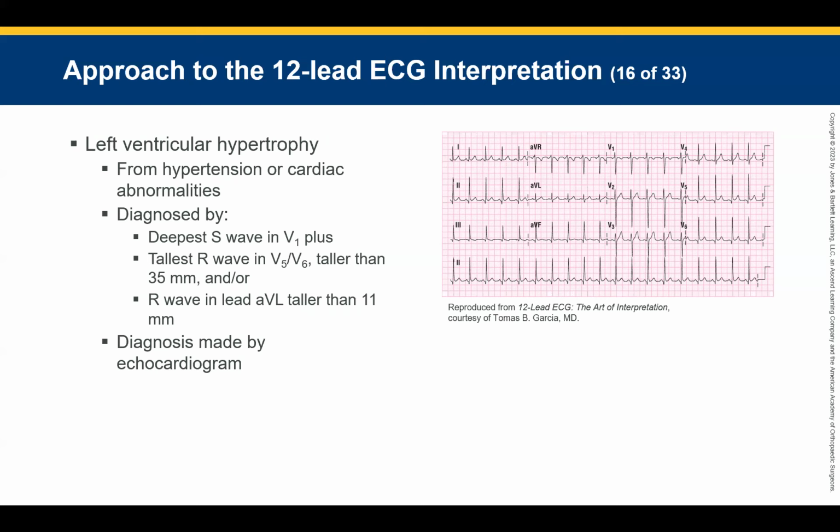Yeah, but you only got one box on the strip. No, not leads. You're talking about leads. I'm talking about the little tiny square boxes at the J point off the baseline. Come here, yeah, it has to have two boxes. 2 tiny boxes of elevation off the baseline. You got crazy for a second. I thought you were talking. We almost lost them all. No, you're good.